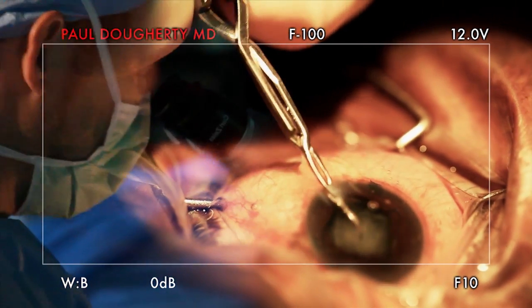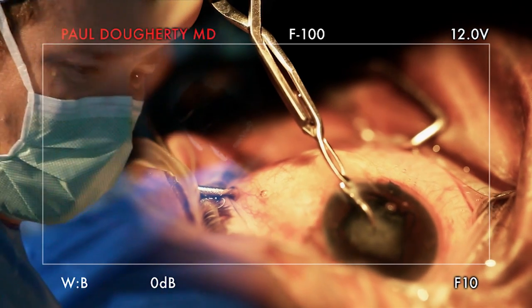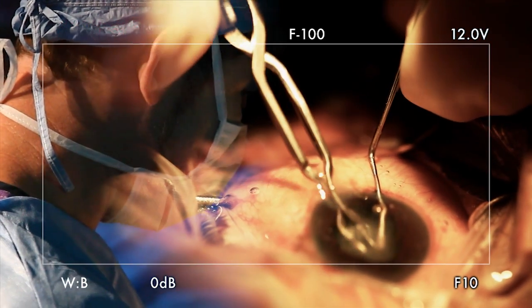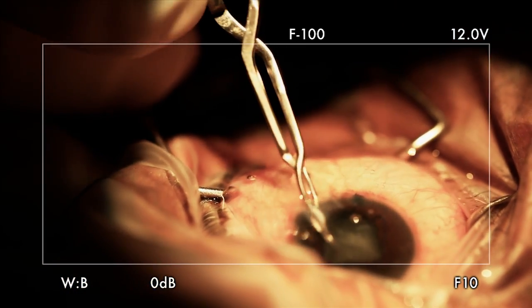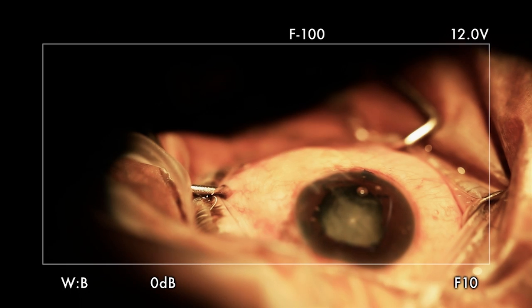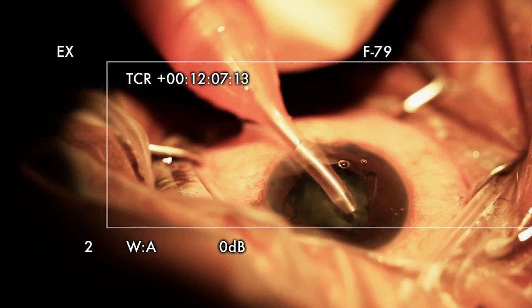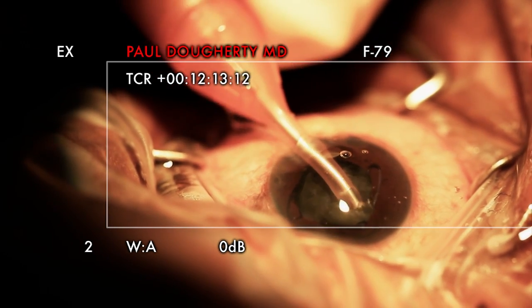That's a second instrument — it's pretty tight. I'll make it a Szynski hook. Let me hydro-dissect a little bit more; this just isn't spinning away. There's no easy cataracts in Haiti. But this one, I think, is really a big rock — we're gonna do this.